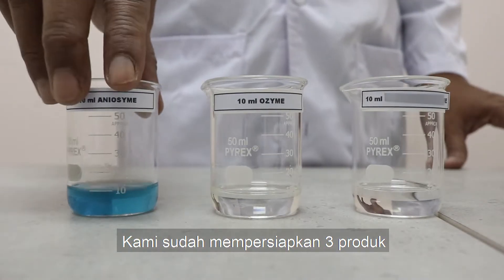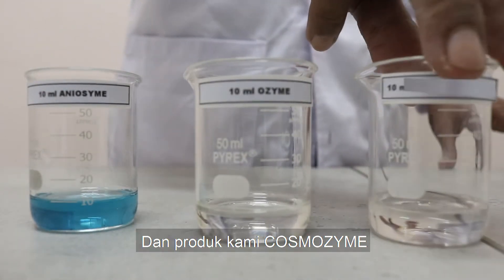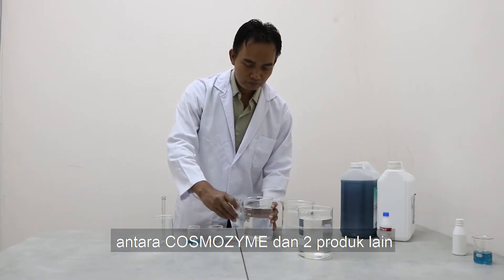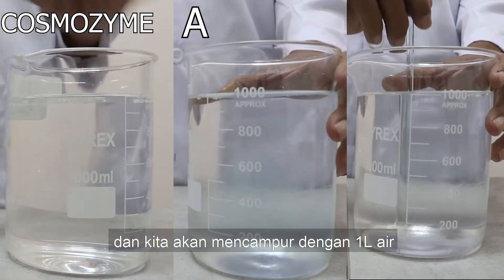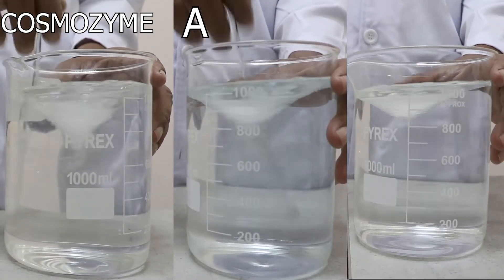Here we have three products: Product A, Product B, and the last one is our product, Cosmozyme. We will test the cleaning power strength between Cosmozyme and the other products. We have prepared 10 milliliters for each product and will mix it with 1 liter of water. Stir each beaker until the solution is mixed perfectly.